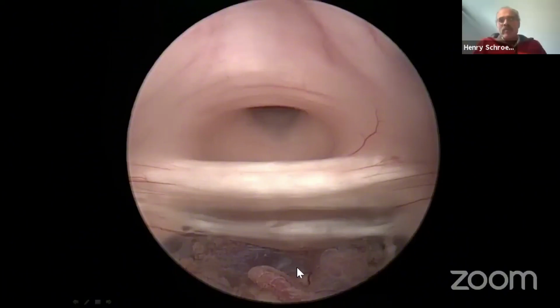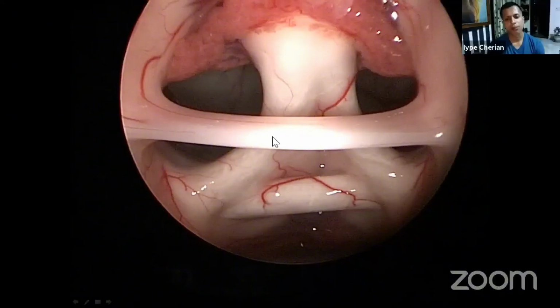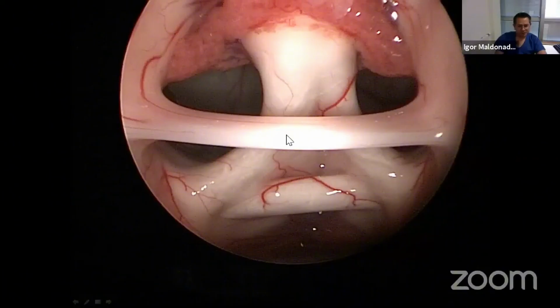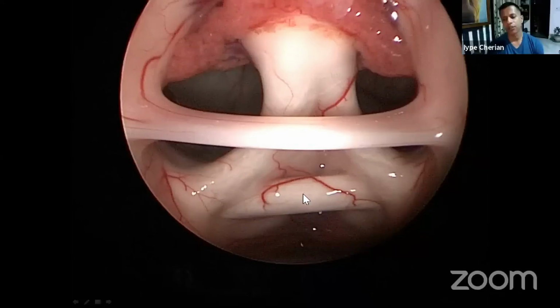This is called the suprapineal recess, and you see the choroid plexus on the roof of the third ventricle. This is the ideal anatomy. What is this? Fornix. Massa intermedia. Exactly. And this one? Posterior commissure. Anterior commissure. Very good, very good.